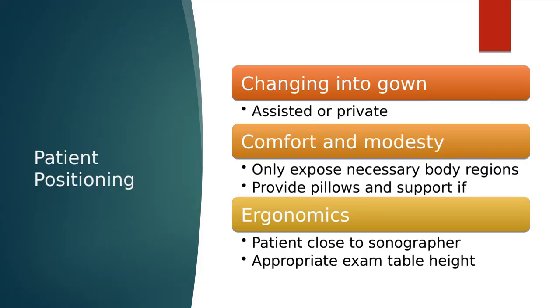Patient positioning, this is very important for us. So again, we want to make sure that we are offering communication and assistance to our patients, especially when they have to change. You will see a lot of techs in outpatient facilities. They don't necessarily change their patients into gowns, but that gel kind of gets everywhere. So sometimes if you see a patient coming in a nice business suit or in a beautiful dress, you might want to offer to them to change into a gown.